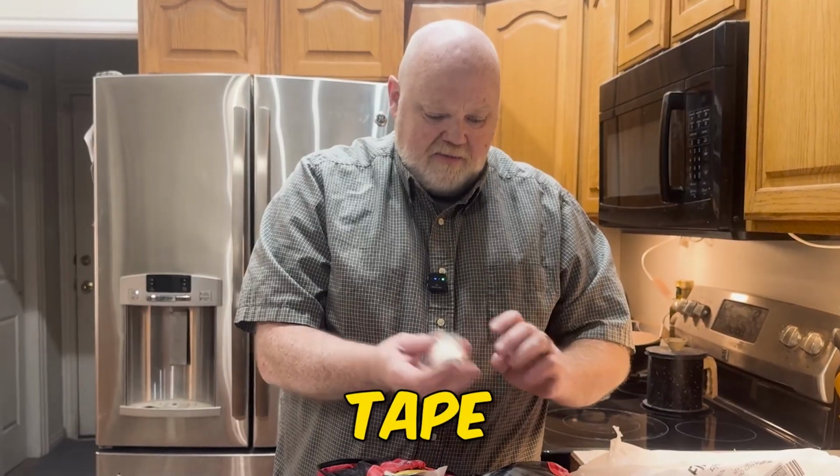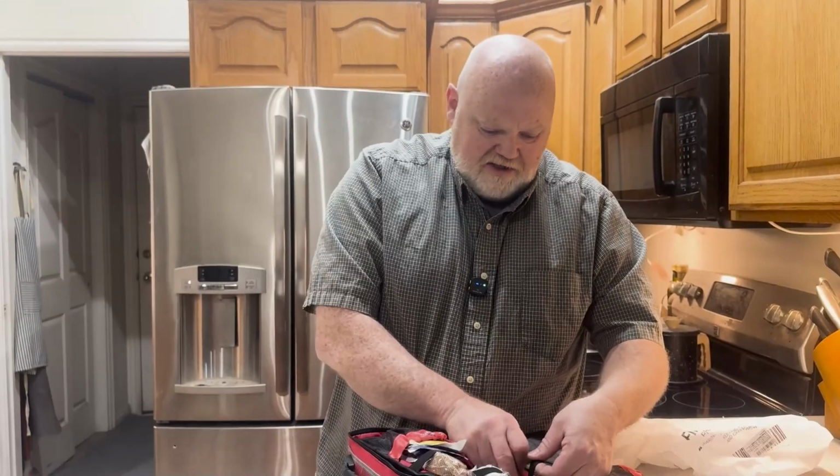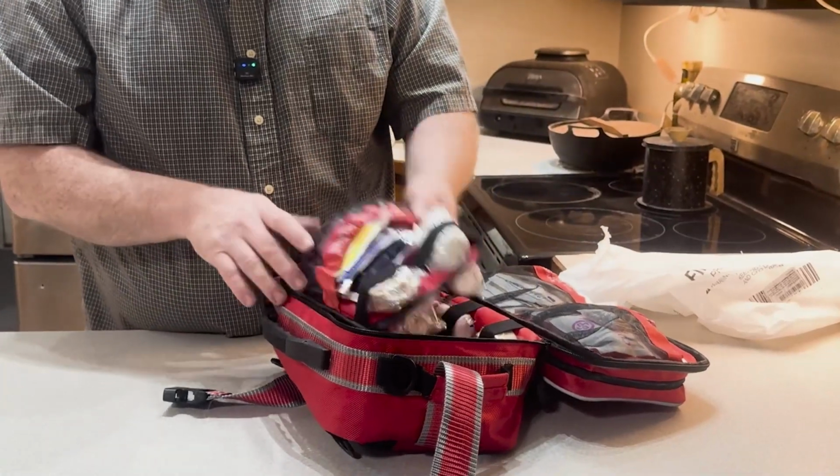A little bit of tape, medical tape. I would up that. I'd get some bigger. The thing with tape though is you always have to change it out. So you don't get huge rolls because they lose their adhesiveness. Same with Band-Aids. You're always having to change it out. And then this is cool because it flips over.